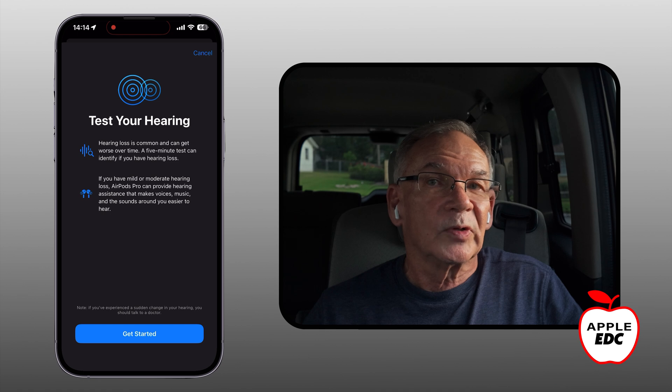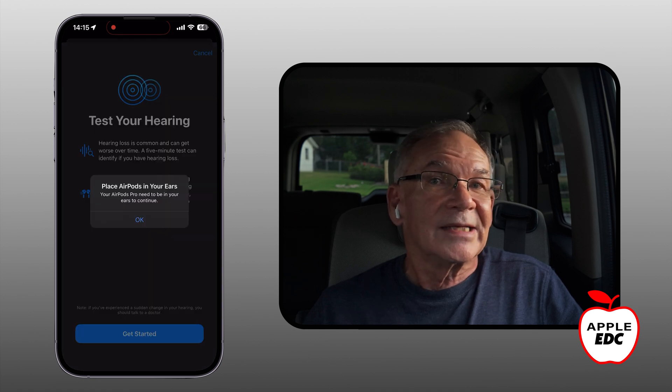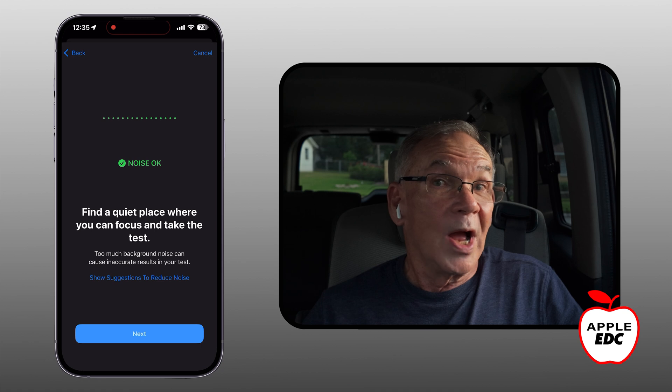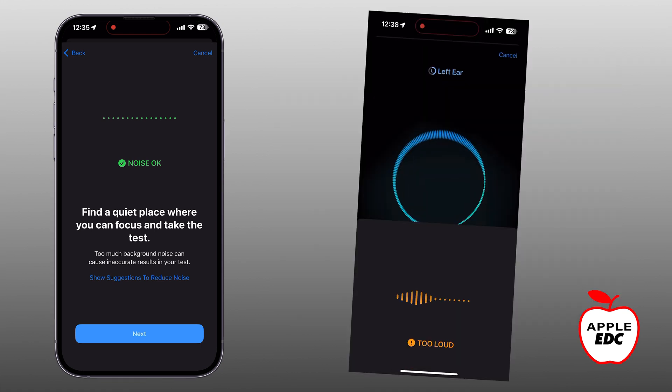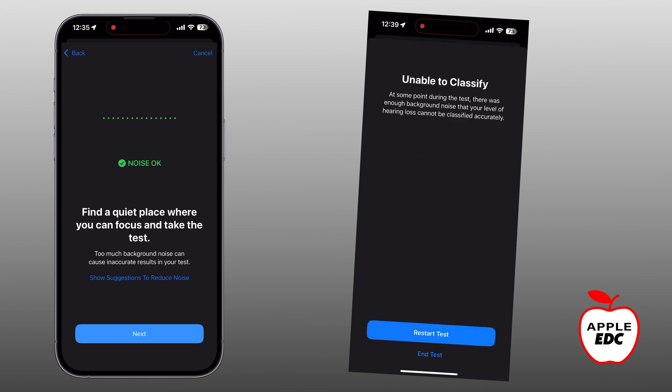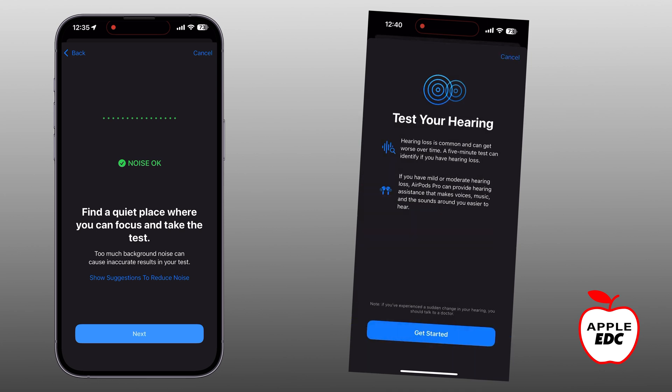It gives us a setup screen and we can get started from here. The test takes about 10 minutes. It tells you to put your AirPods in your ears, then it asks you some pre-qualifying questions. Next, it will ask you to find a quiet place where you can take the test. I learned this the hard way — if there's too much noise any time during the test, it will pause and you'll probably have to start it over.